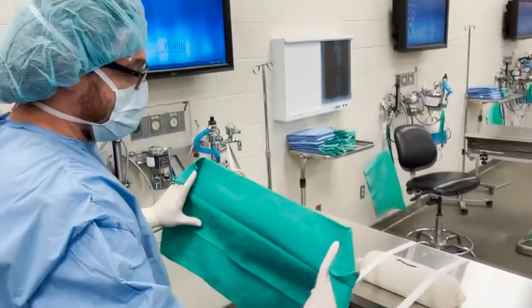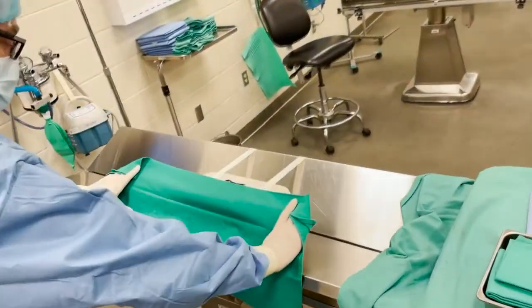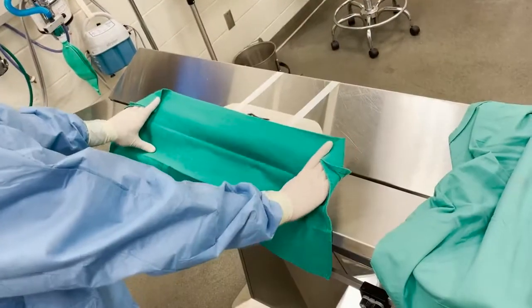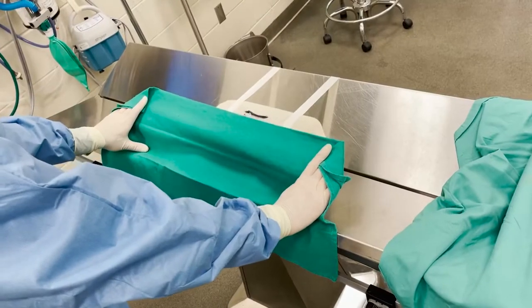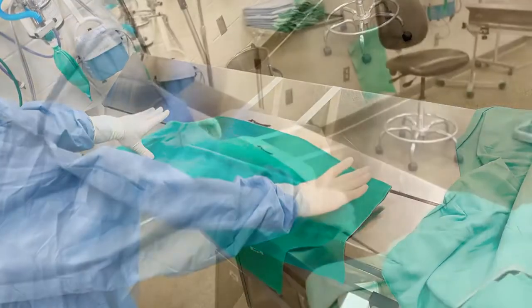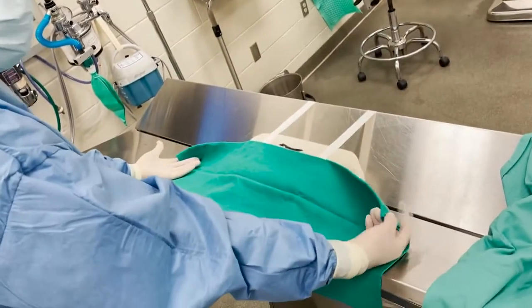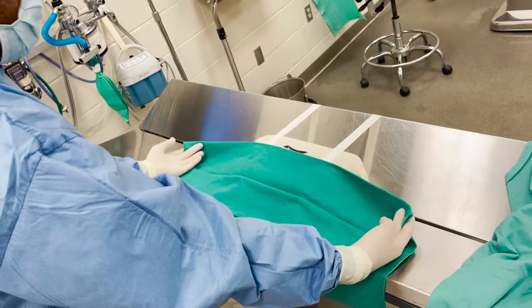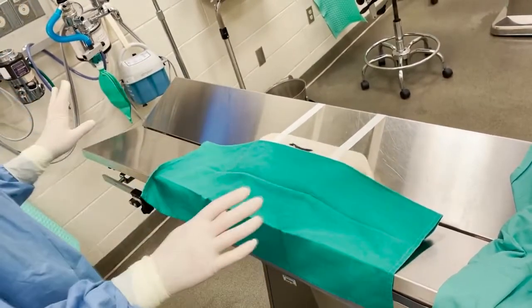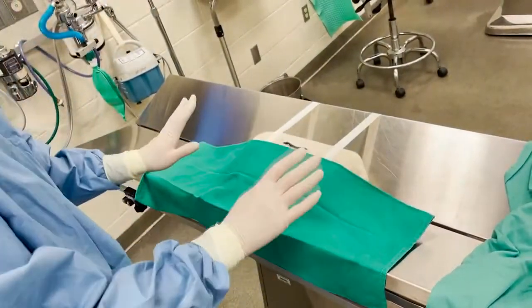I go ahead and place it — I get my thumbs like a kickstand on the table, then use my hands to put it right where I want it. Once I touch the patient, I just let it go. The common mistake is rolling your hand — you don't want that; your fingertip would be facing the non-sterile stuff. Just drop it and let it be. If it's not completely perfect, don't grab it and fix it because you could break sterility — not worth it.